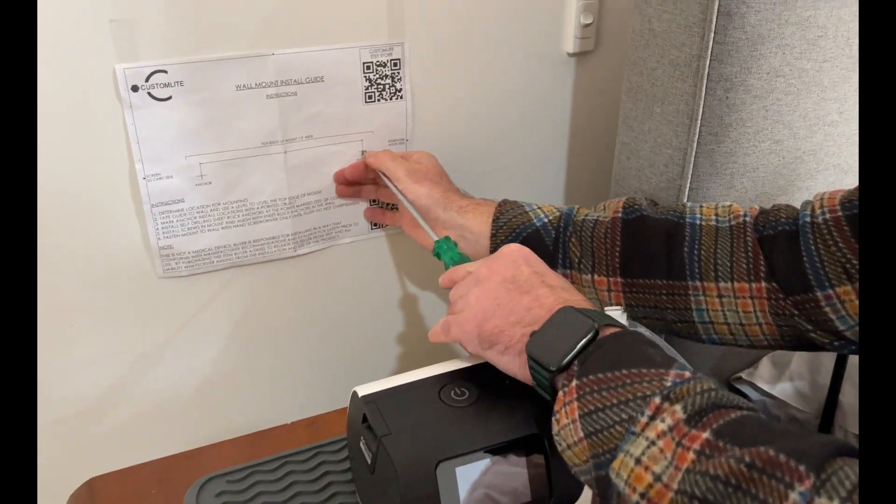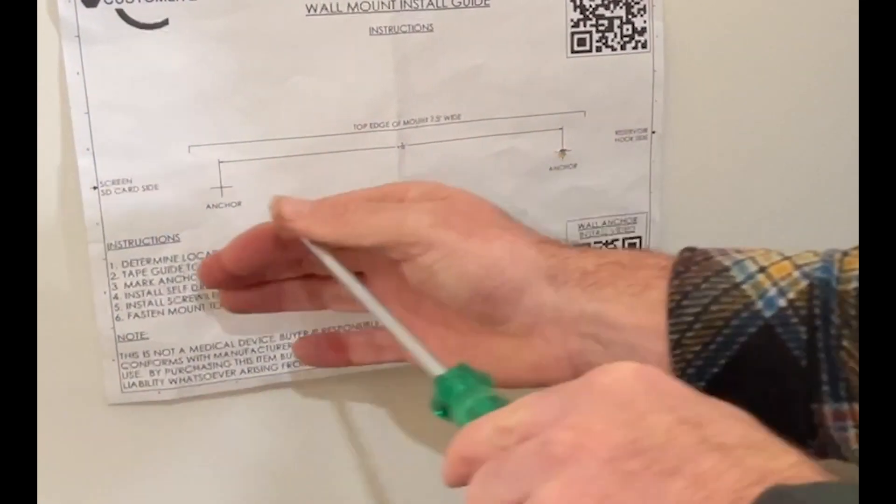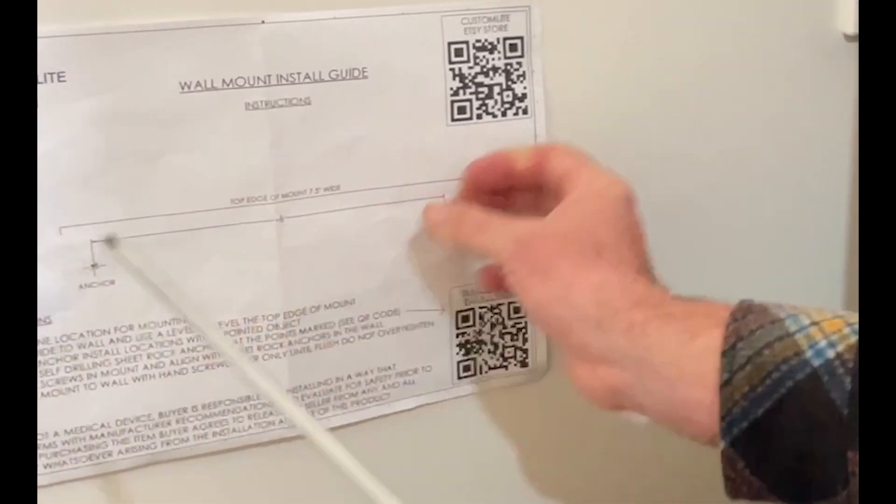Now what I'm going to do, I'm going to take this and I'm just going to make a little dent. Right there. Right there. There we go. Check out those two little holes there — one, two.